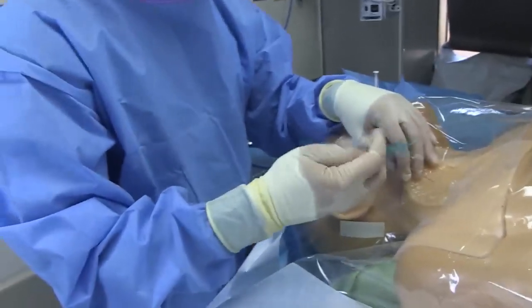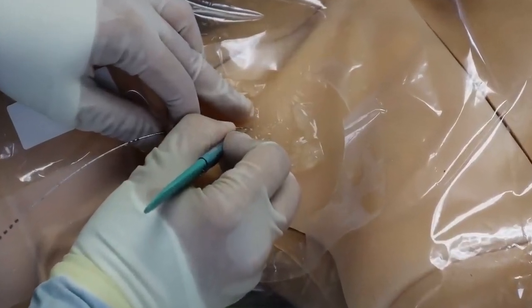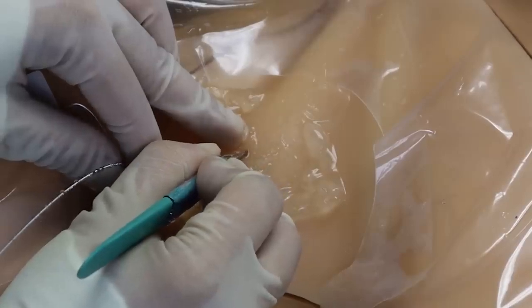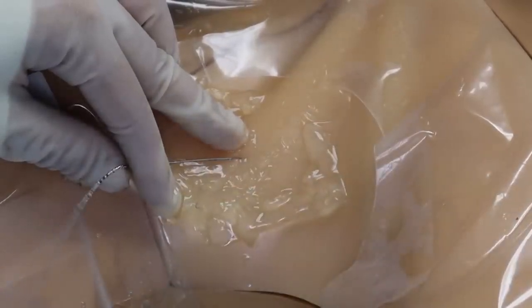Next, grab the 11 blade and slide it down the wire, inserting just the tip right into the puncture site with the sharp edge facing away from the wire. Apply pressure away from the wire as you pull the knife out of the skin to make a small nick at the skin which you can fit the dilator through.